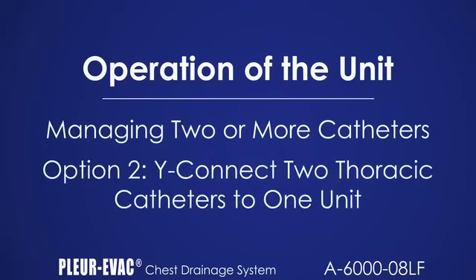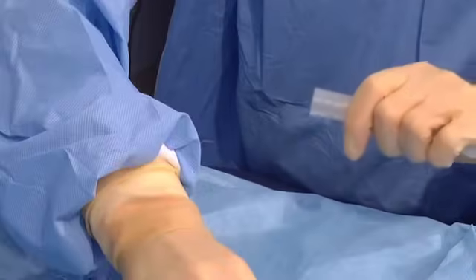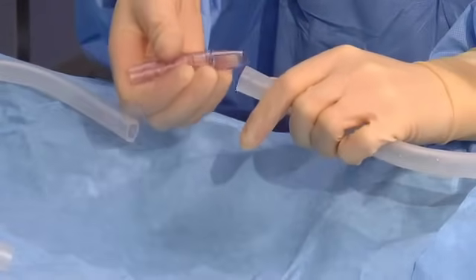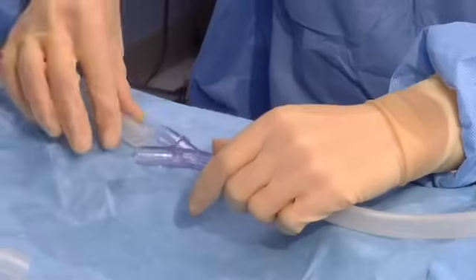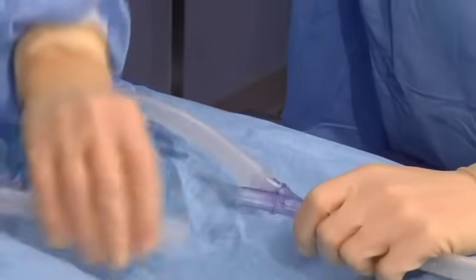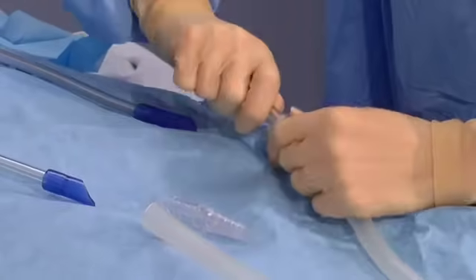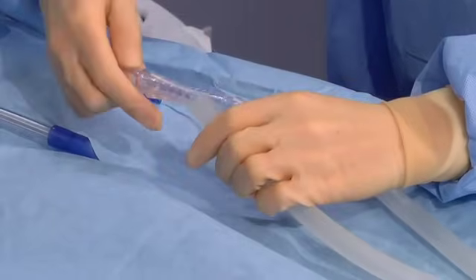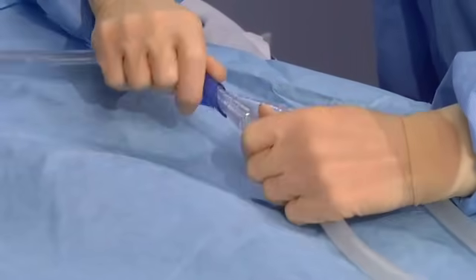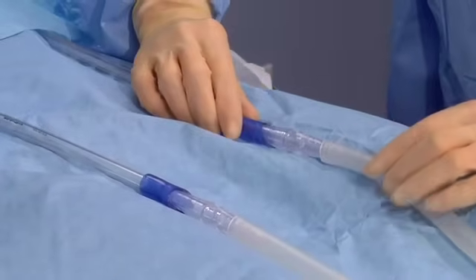When wiring two thoracic catheters, remove the protective cap and straight connector on the Plurivac tube and discard the cap. Insert the 3/8 inch sterile Y-connector into the Plurivac patient tube. Obtain and insert two sterile small tubes to the Y-connector. Note, Plurivac tubing may be used if no separate tubes are available. Attach a connector to each short tubing section. Attach two short tubing sections to the two thoracic catheters. Note, if two thoracic catheters are used, both must be attached to a Plurivac unit.